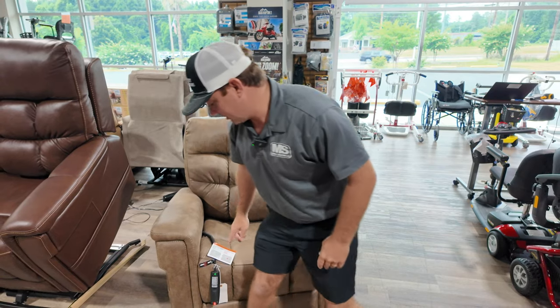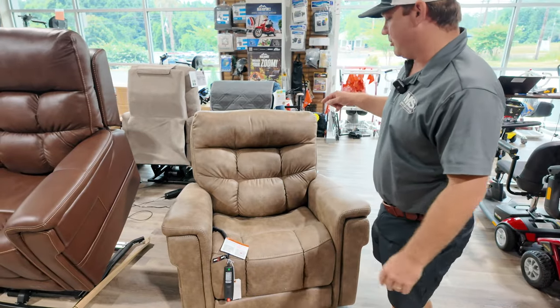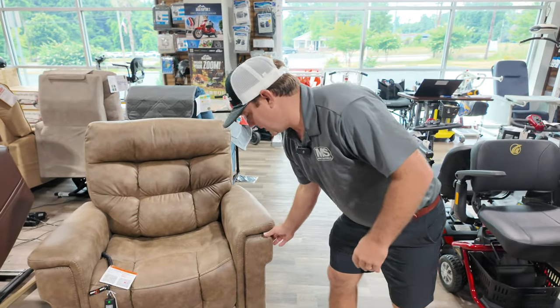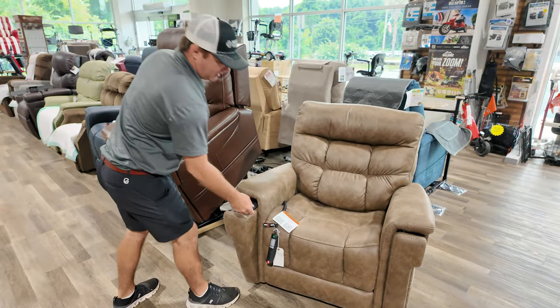Check out the specs. I believe this is like 18, 18.5 inches from the ground to seat height. This also has lumbar, power pillow. You can adjust the feet, the legs, cup holder, wireless charging port, and you have heat.